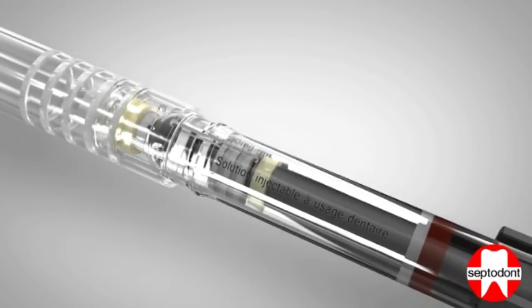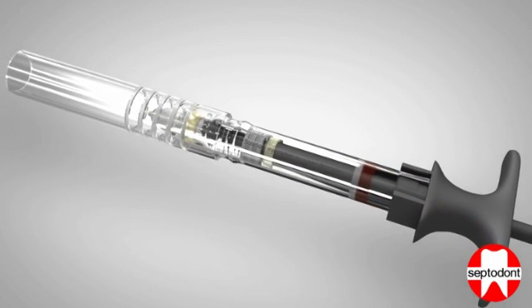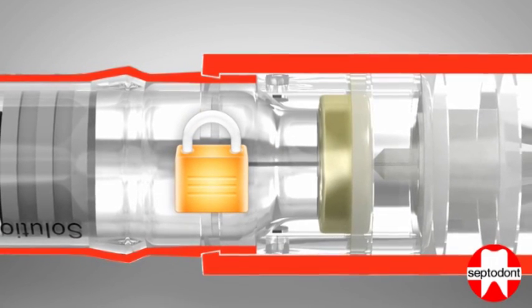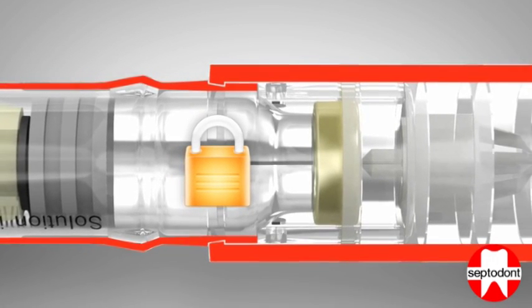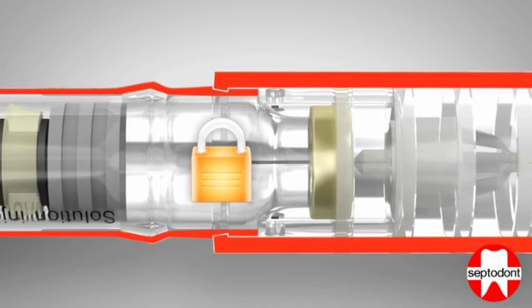The device is now in the final locking position. Warning: when the device has been locked, do not try to force the protective sheath off the locked position. Instead, the syringe should be disposed of safely and a fresh syringe assembled to complete the procedure.